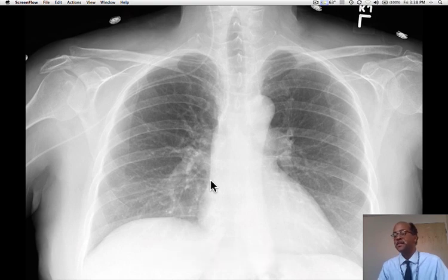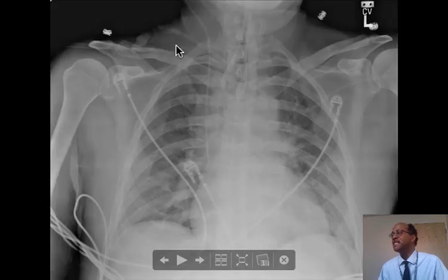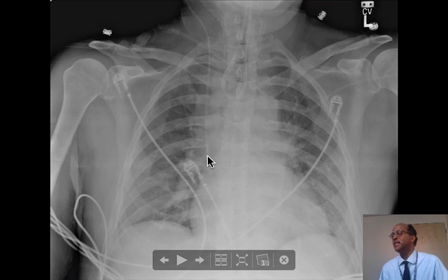Here is another case of a patient who has a properly inserted internal jugular catheter. Here is the internal jugular vein, and it continues down, with its tip in the superior vena cava just above the cavo-atrial junction.